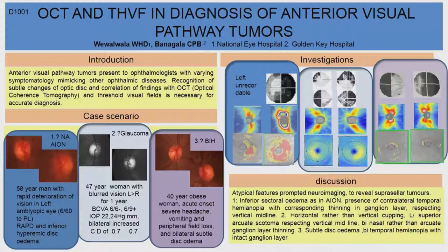The most striking feature is the hemibinasal thinning of the ganglion cell layer. So this was again suspicious, and she actually had a pituitary tumour.